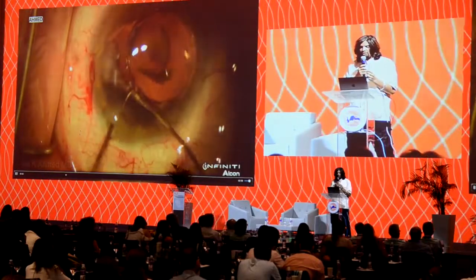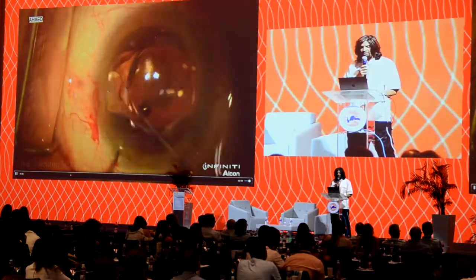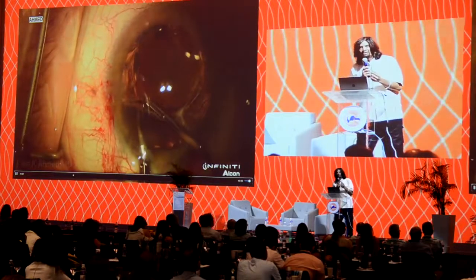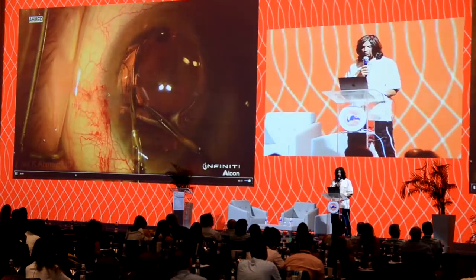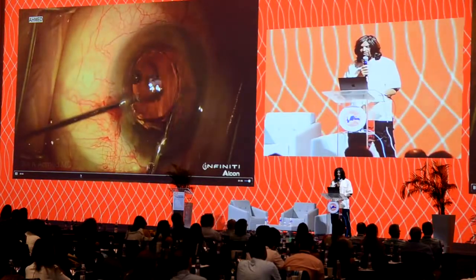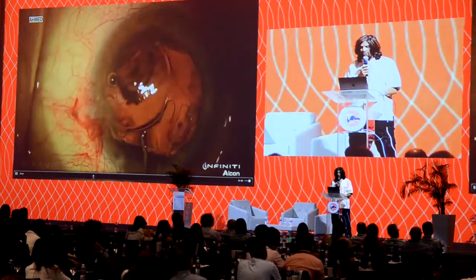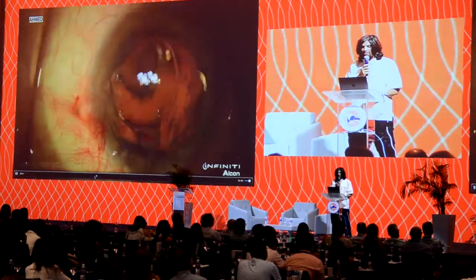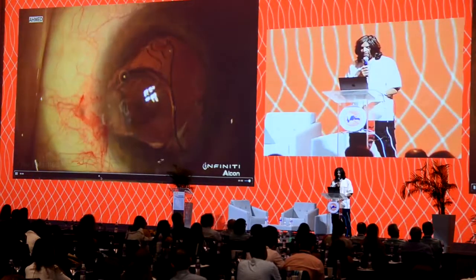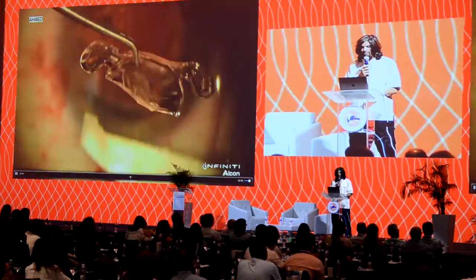And then we can inject viscoelastic here. Now, it's not always easy to look at the haptic here. It's encased within fibrotic tissue. So we're going to cut the haptics from the optic on this side. And we can always leave that as well. Cutting the haptics further, we were able to at least extract one haptic on this side. And then we can cut the lens in half and remove it.